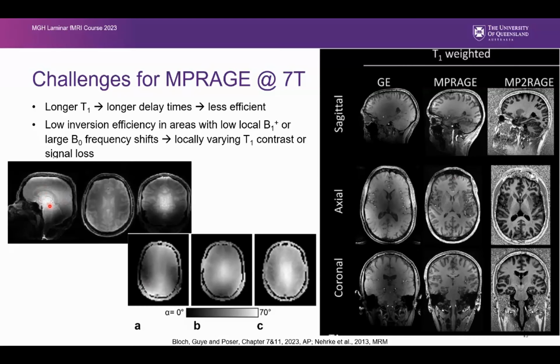And people were very disappointed when they saw it, because everyone's like, oh my gosh, the first 7T images. And it looked really bad. It has this really central bright artifact. And this is basically just a constructive interference of the RF. It just gives you a lot of signal in the center and not a lot in the outer areas.